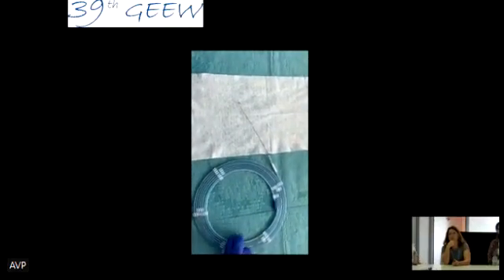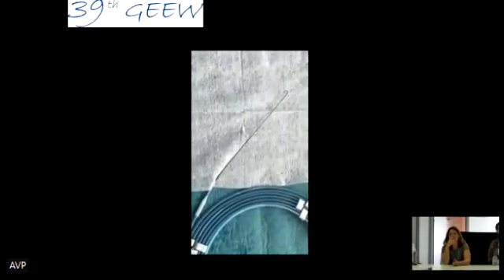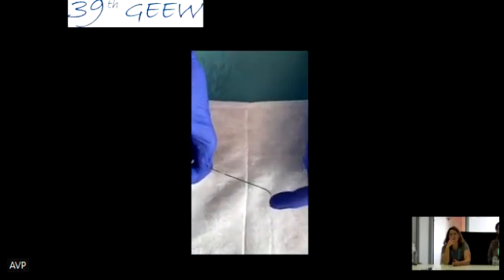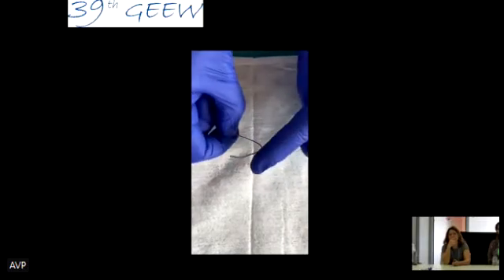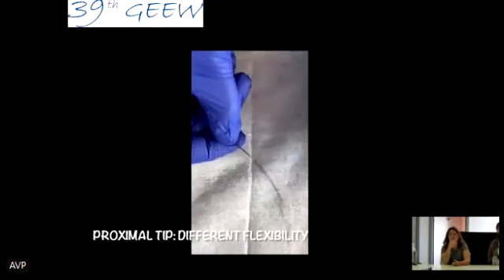So this is the first video with the different guide wires, and this is how it's mounted. You see the tip, which is not a straight tip here, and the end is flexible. It's friendly with water, and you see clearly the difference between the tip and most of the guide wires have a very stiff body, but the tip is very flexible, as you see here. So you can imagine it can go easily to search the way in.